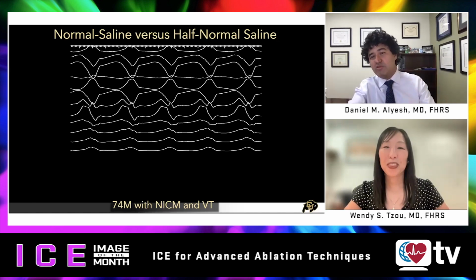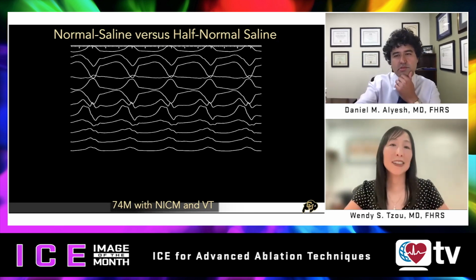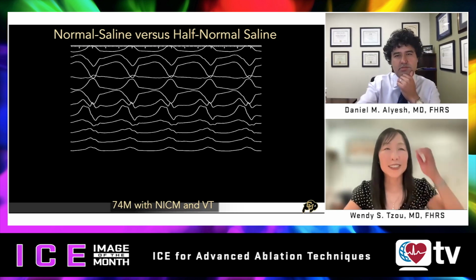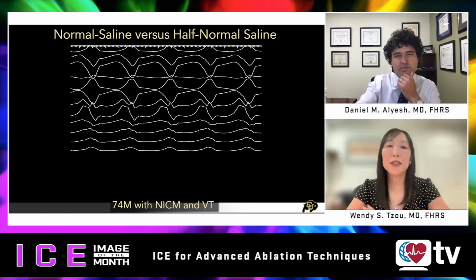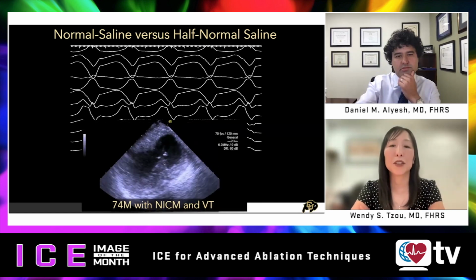Okay. Normal saline versus half normal saline. Yeah. So that prior paper that you showed was a study of normal saline irrigant, which forever was the standard, and actually still is kind of the standard. Half normal saline was introduced as a modality to increase the depth and size of ablation lesions. And so this was really utilized in the context of tough VTs, tough ventricular substrate.